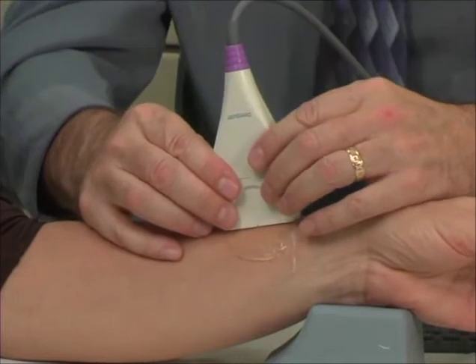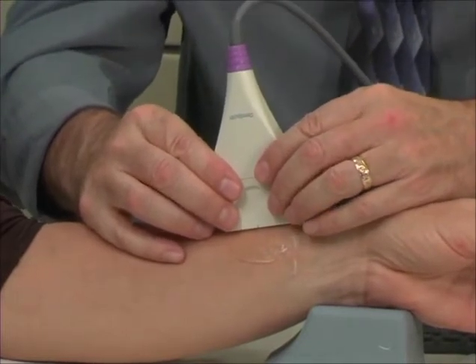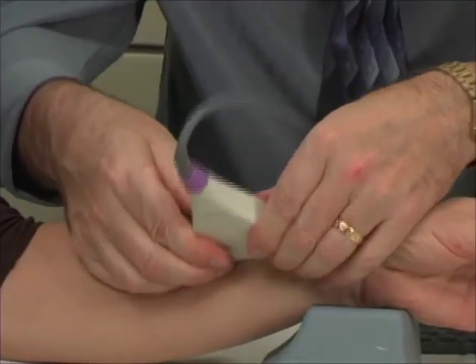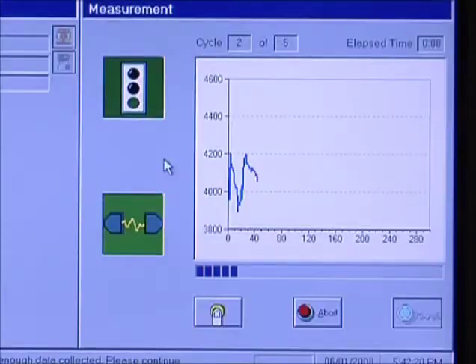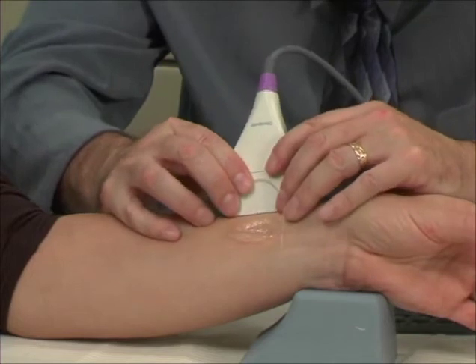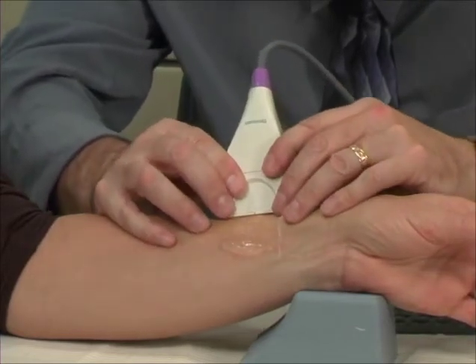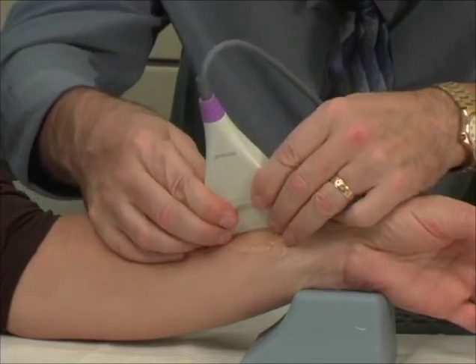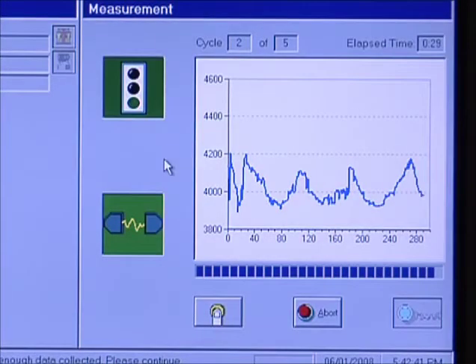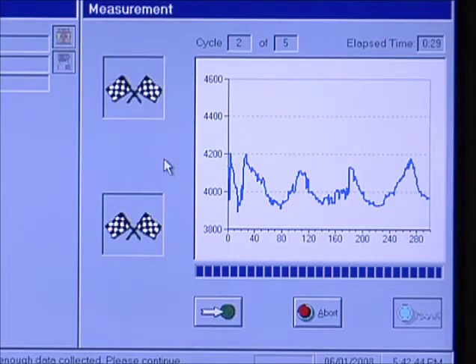And now we're going to start the second cycle, and I'm going to kick the foot pedal and you'll hear the same again. So let's do that. And we start again. 1,000, 2,000, 3,000, 4,000, 5,000. There we've come to the end of the second cycle.